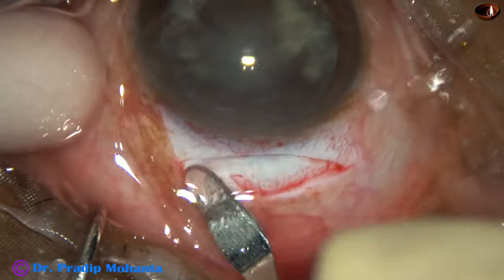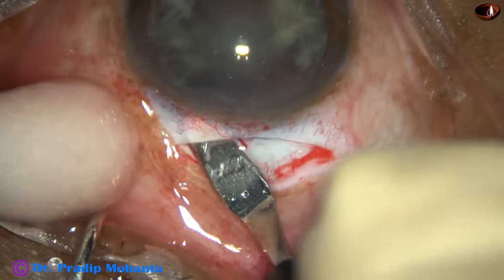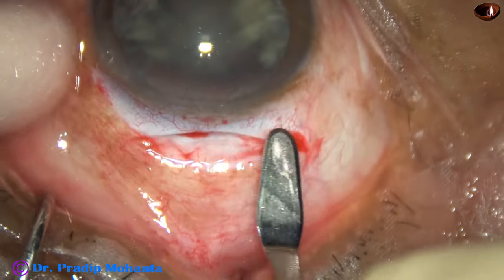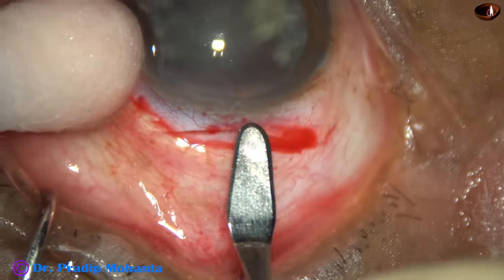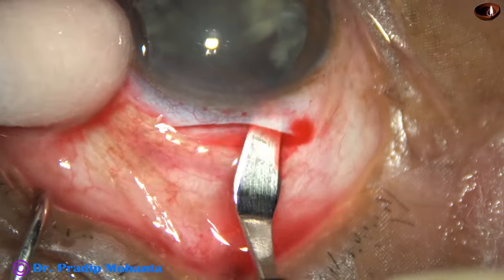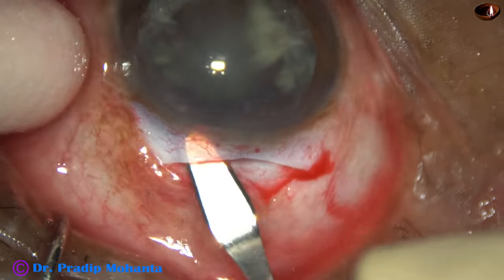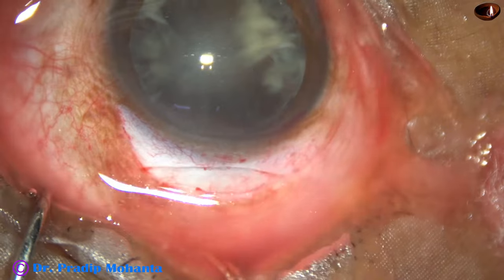The crescent blade comes backward and to the left. In this way, we are making the tunnel of the left half. The inner opening will be a little larger than the outer opening. Outer opening is about 7 millimeter; inner opening will be about 8 or 9 millimeter. We must remember the contour of the eyeball when we sweep backward and to one side, either right or left, and the same plane should be maintained. The tunnel is blind now and will be opened later on.